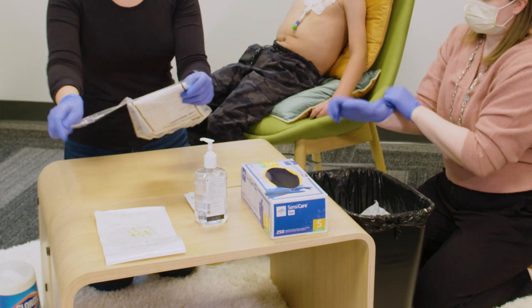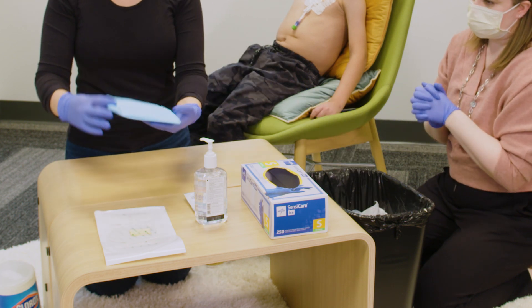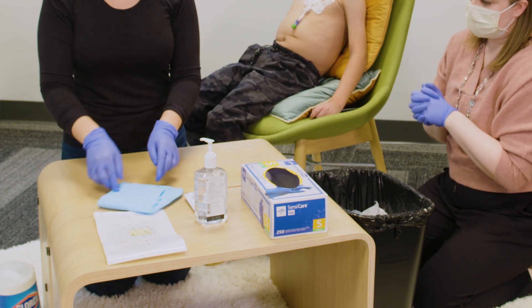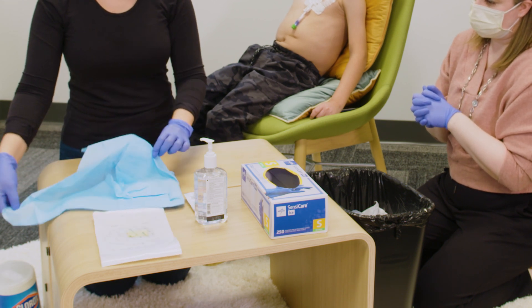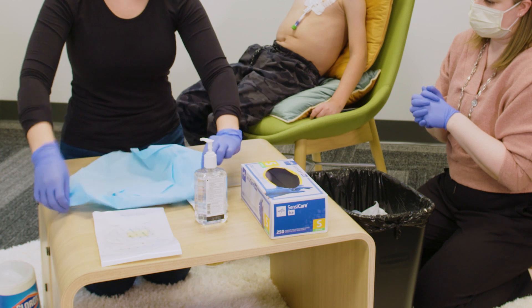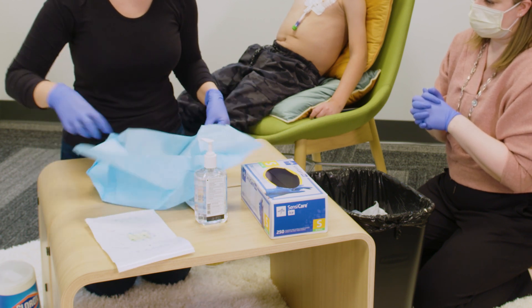Gather your supplies. Open the dressing change kit, making sure to keep the inside of the kit untouched and sterile. If you need to, it is okay to touch a 1-inch border along the edges of the kit. The contents of the kit are sterile — do not touch the inside without sterile gloves on.